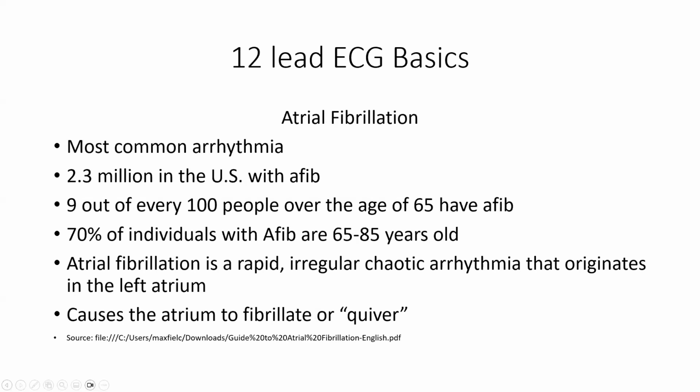Atrial fibrillation is a cousin to atrial flutter. If patients have typical flutter, they are prone to develop atrial fibrillation in the future. That timeline is unpredictable. We have a bigger concern with AFib as it can be a risk factor for stroke. And again, it's very common.